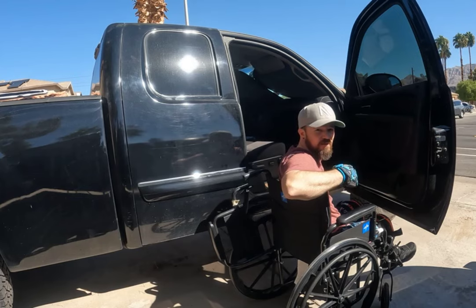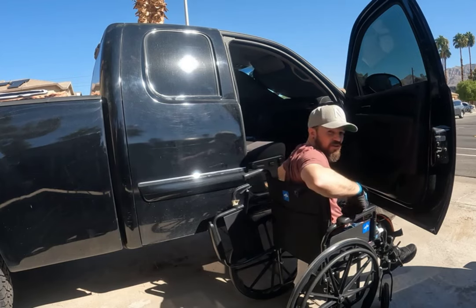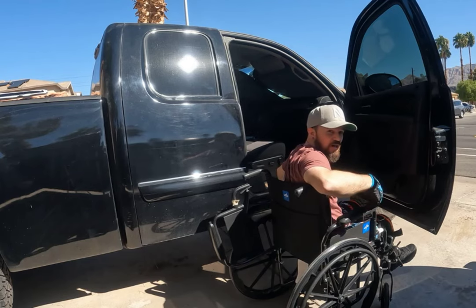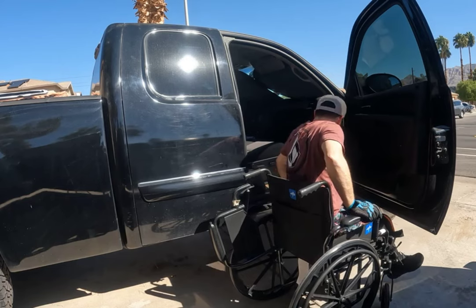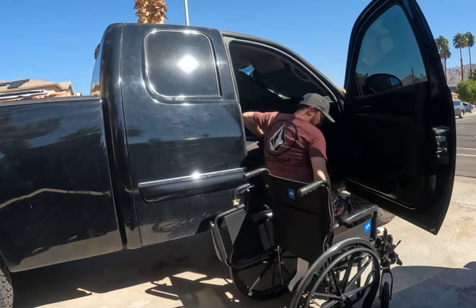Please be very careful — they call it a slide board for a reason. If you're not careful, you're going to slide right off this thing and fall on the ground. I'm not an expert at this, I'm just showing you how I do it. Hopefully it'll help some of you, because I found no videos on how to get into a truck from a wheelchair — they have vans and cars, but not this.